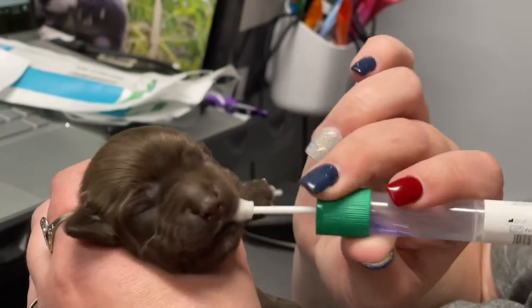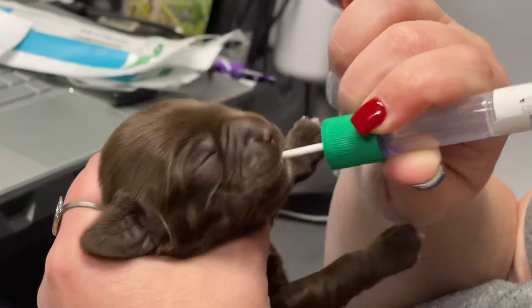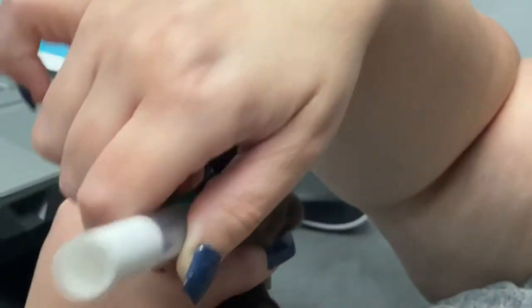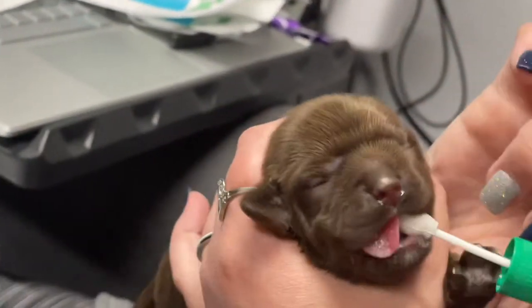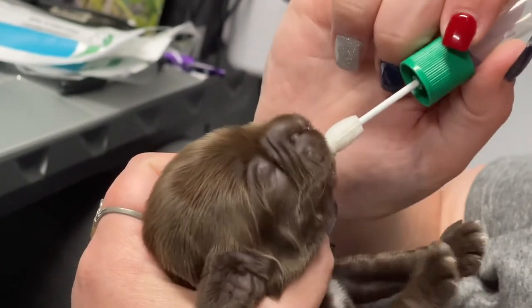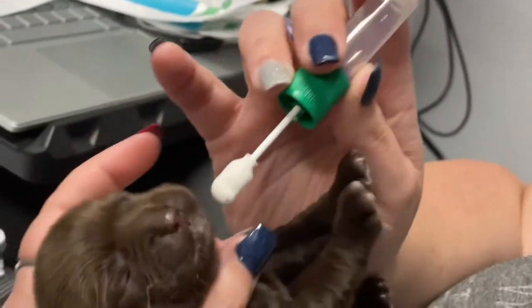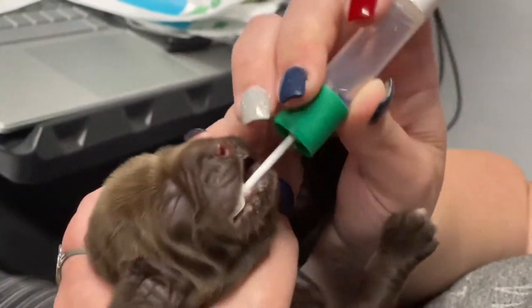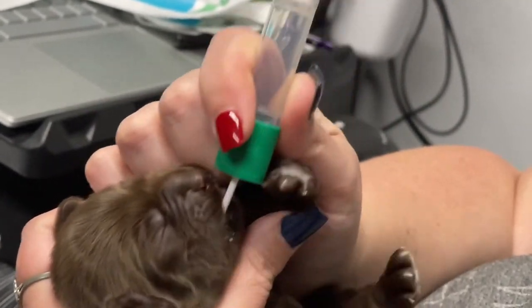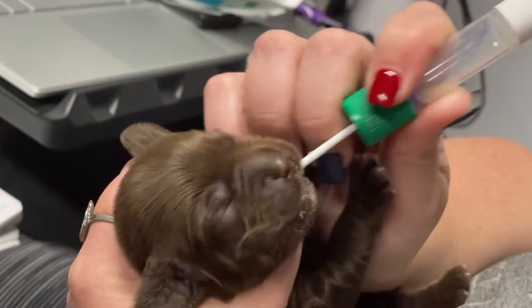You're just going to wiggle it. She's kind of hungry, so she's going to open her mouth. Let me get this in there — I'm going to stick it in her cheek and just wiggle it around. She's going to get a little irritated, but she'll be okay. I'm going in the other cheek and wiggling it around. I'm not choking her with it — it's in her cheek, not down her throat. She's just mad because she thought she was going to get milk and there's no milk.